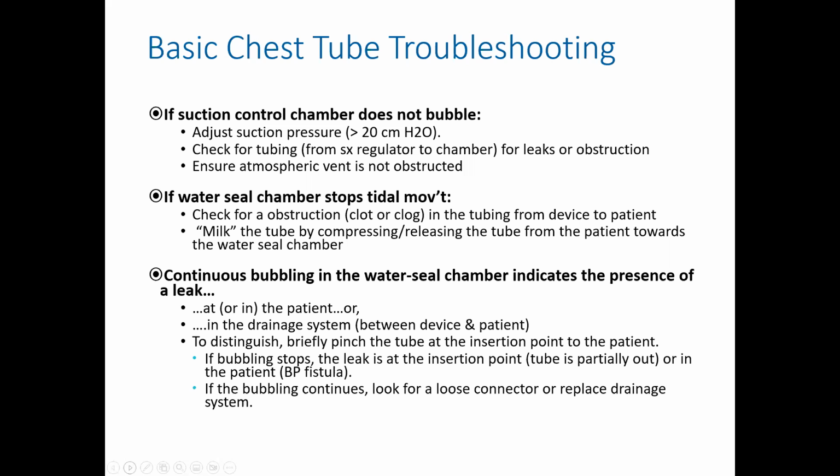Basic troubleshooting. This is kind of an important slide. I think it's reasonable to expect that you'd have 1 or 2 questions out of your total of 140 questions in the exam, but they're going to throw those extra 20 at you that aren't going to count. They're just not going to tell you which ones they are. It's reasonable to expect there'd be 1 or 2 questions on troubleshooting chest tubes, and then other questions on just where they're placed, why they're placed, recognizing the need for them, etc.